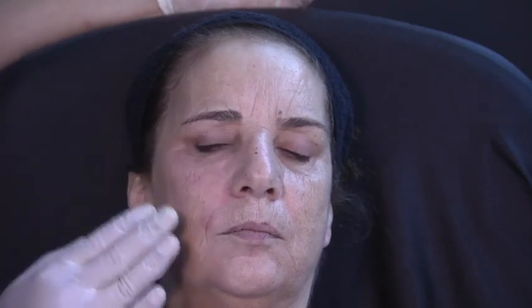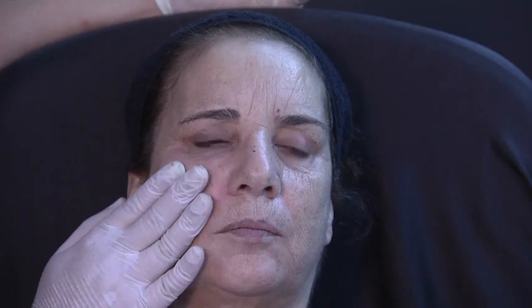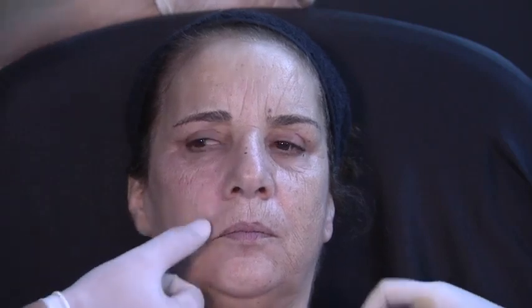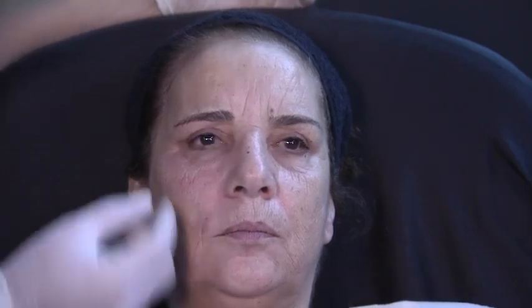Remember that Nasha Vital is still a Nasha technology, and I have seen a lot of cases from colleagues from other countries that only focus on skin boosters, and they do have a lifting effect due to the capacity of Nasha injected superficially in the dermis to even lift the skin. That will reduce the amount of product that we will need deep later.